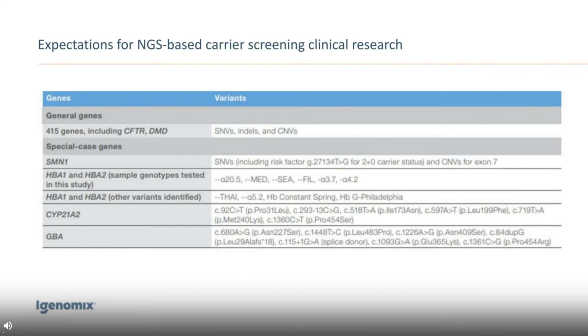In this panel, it was really good because of this effort to increase the amplicon coverage to enable potential single exon resolution in these 33 focus genes. Take for instance CFTR, the cystic fibrosis gene, which we know is a really difficult gene to sequence. We had a really good experience with this panel. We were able to see in our validation that the gene was covered really well. All the samples that have any type of variant in this gene, we were able to see the result when we analyzed in the pipeline.